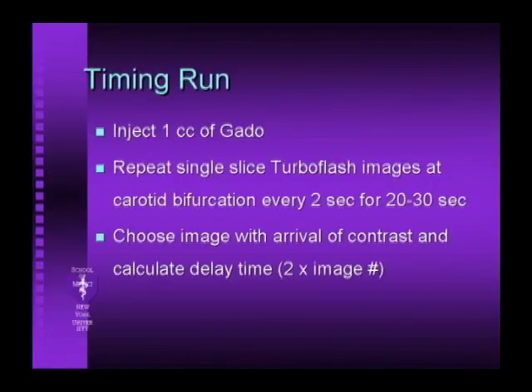The problem with cheating is that it doesn't always work. And who do we study in these patients? In this situation, we're not studying young, healthy people. We tend to be studying old people with multiple system disease. They have cardiac disease, they have other diseases, et cetera. And particularly if they have cardiac disease and their stroke volume is down, then you can start dragging this out to 24, 28 seconds, and that's the problem.